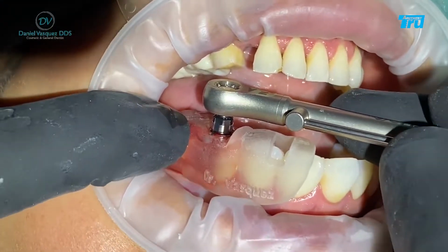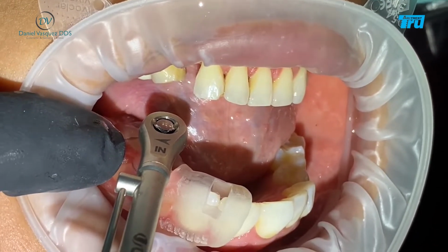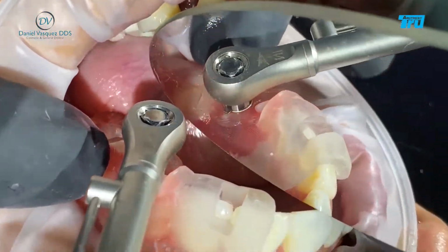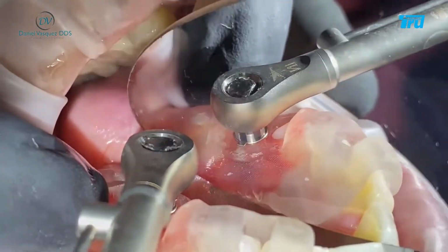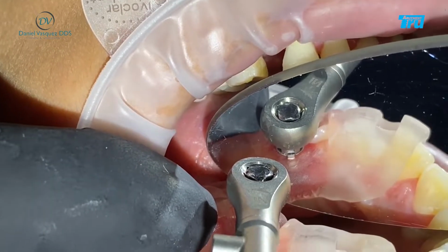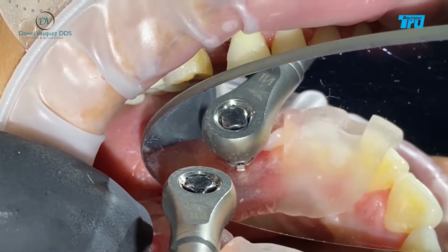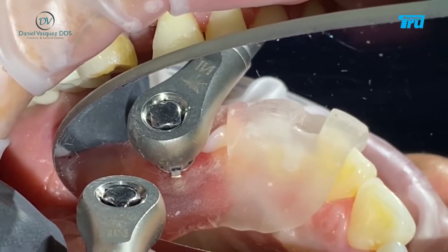Vera, you're gonna feel a little pressure right now. Okay, let me hold the mirror. We're gonna verify. Gonna go to the mirror. The lines that we have on the black line on the carrier and the wing, they're very well aligned. So that's where you want it. Okay. So that's perfectly placed.